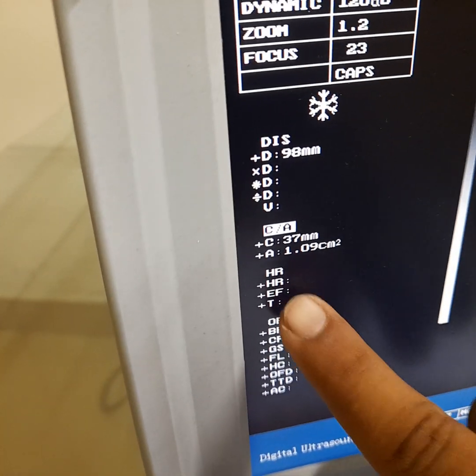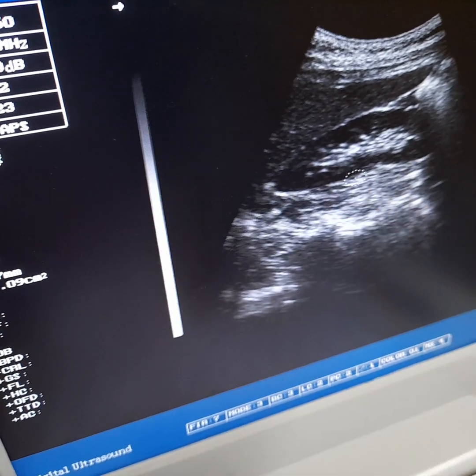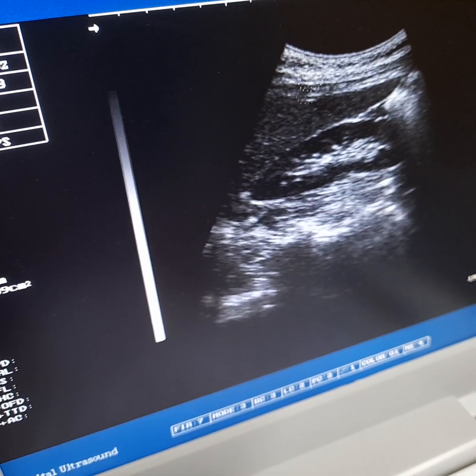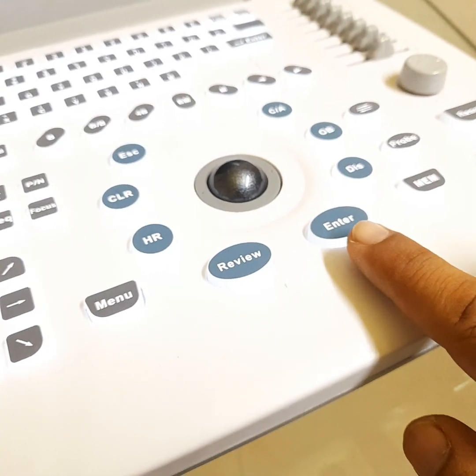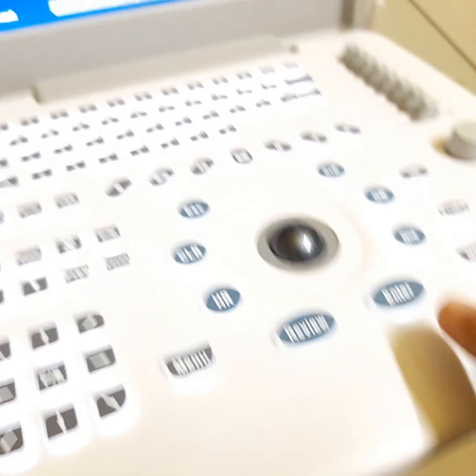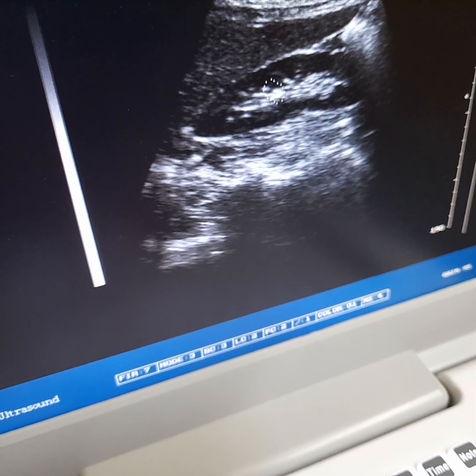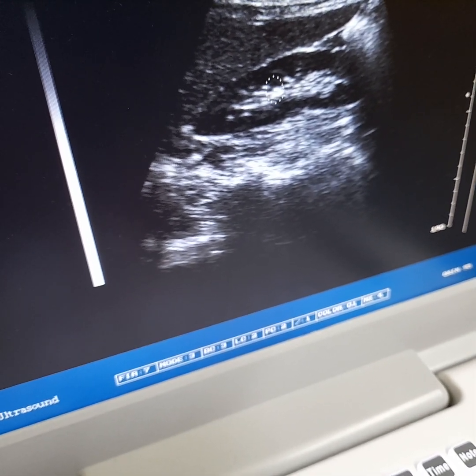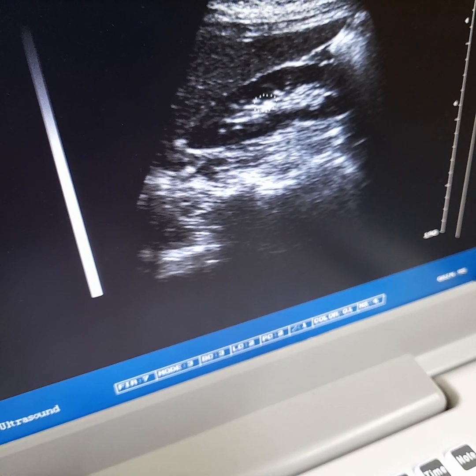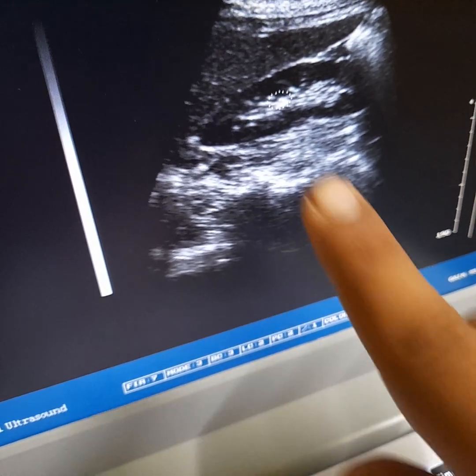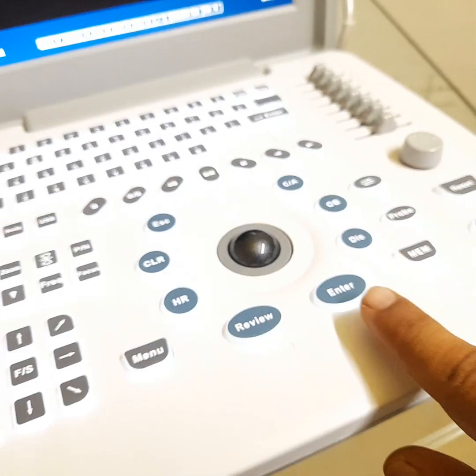CA is now highlighted and the cursor is positioned on screen. You can move the cursor to your desired location. Press the Enter button, then move the trackball to rotate its angle. Set its position to horizontal, then move the trackball and press Enter.